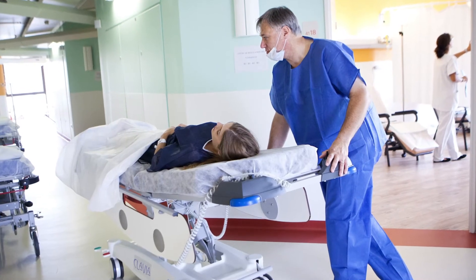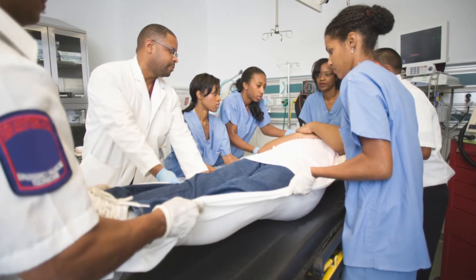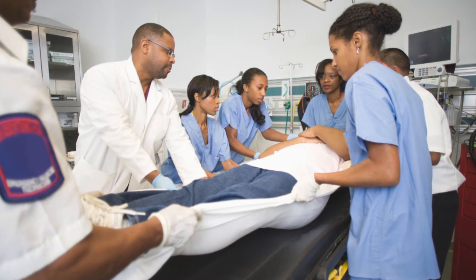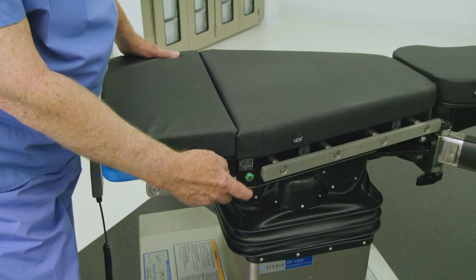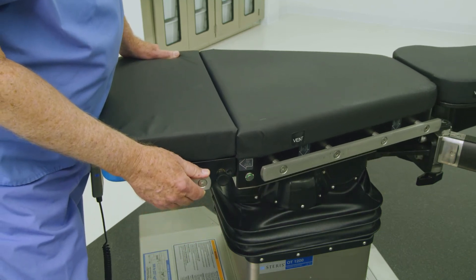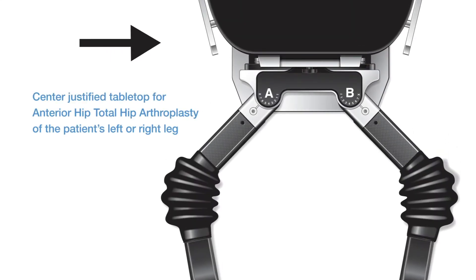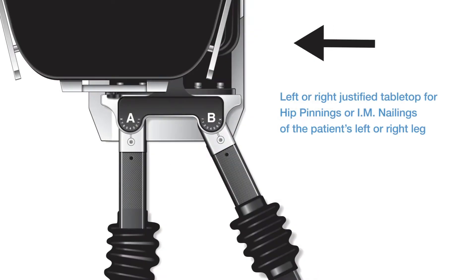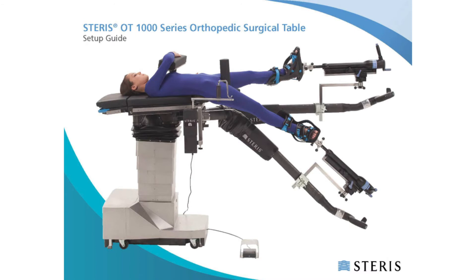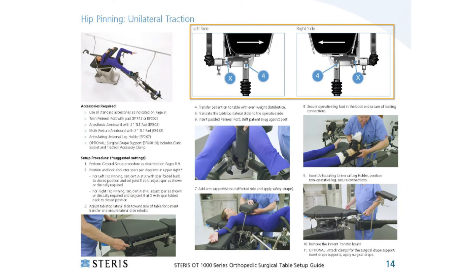The table is now ready for patient transfer. Execute patient transfer using facility protocols for safe patient handling, and ensure even patient weight distribution. Once the patient is positioned safely on the tabletop surface, adjust the tabletop by repeating the instructions to obtain the desired lateral tabletop position. The centered position is typical for anterior hip cases, whereas left or right justified positions are typical for an operative leg fracture or trauma procedure, such as hip pinnings or IM nailings. Refer to pages 8 to 21 of the OT Table Setup Guide to verify the appropriate tabletop slide position.